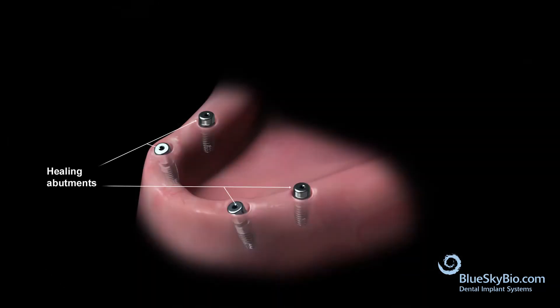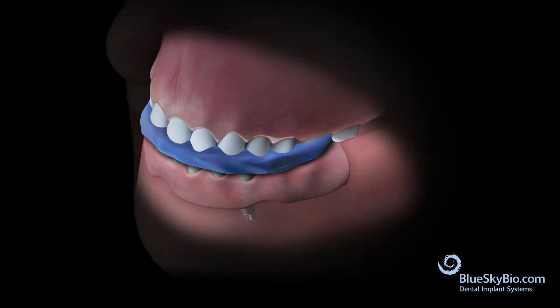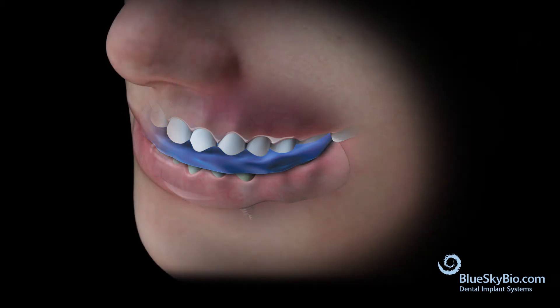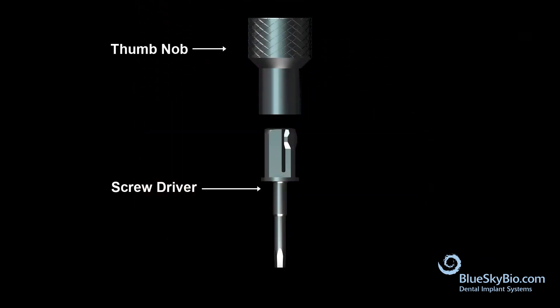Place the denture over top of the healing abutments. Apply bite registration material over the denture and have the patient bite down. After the bite has taken, remove the impression and denture.